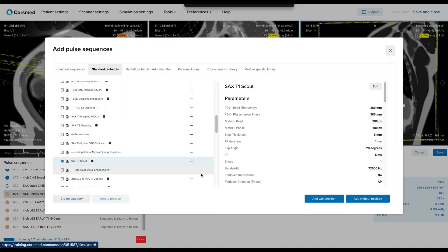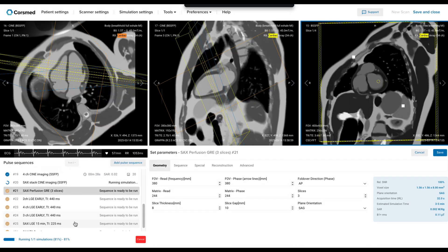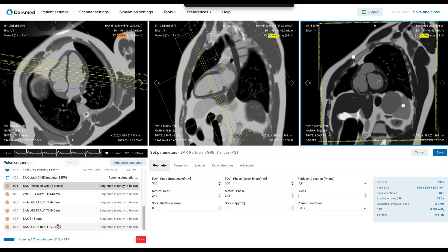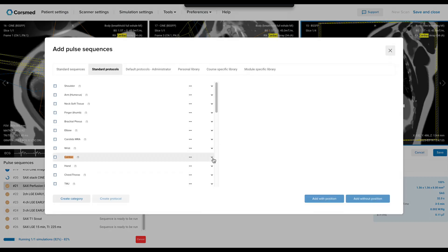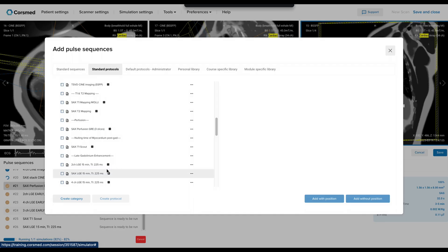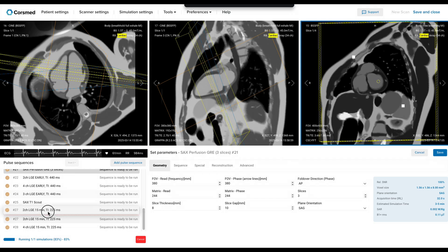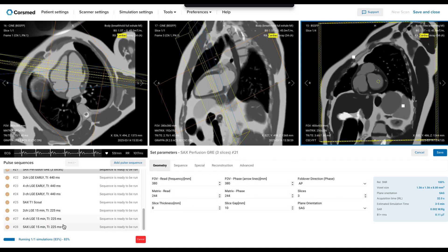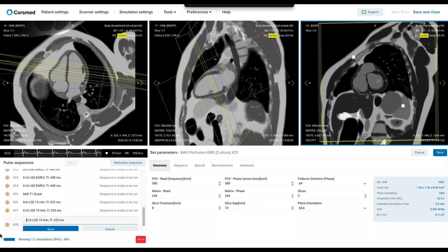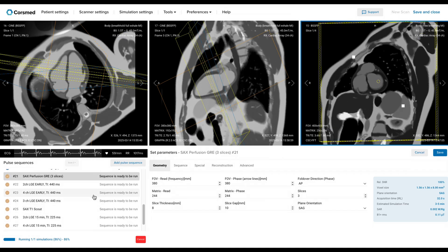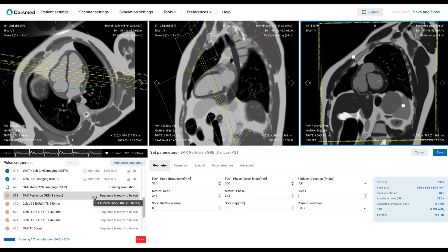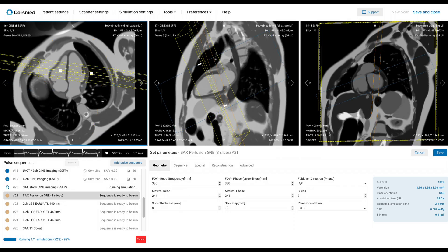Here we have the TI scout, and I'll add it with position. Finally, I'll add the late gadolinium enhancement sequences — the two-chamber and four-chamber views. The three-chamber view was missing from our sequence list, so I'll clone this and make sure we also do the three-chamber. Before you launch the perfusion, you should have all these sequences planned and ready to go, because when you administer the contrast injection, you need to check that the patient is handling the injection well. The more we prepare before the injection, the better.